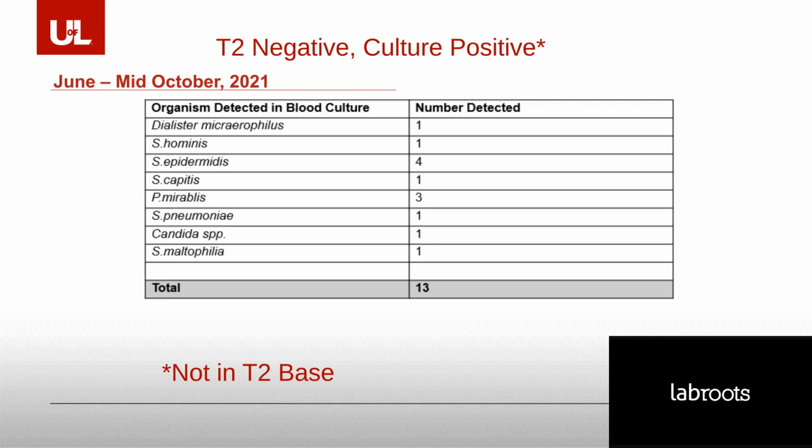Now, the Candida species obviously was recovered, but it was not detected by the T2 because of the specificity of the T2. So once again, these organisms are not in the database, and as a result, the T2 will supplement the blood culture, and phenotypically, it's very, very important to realize that.